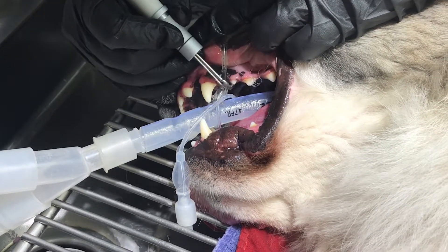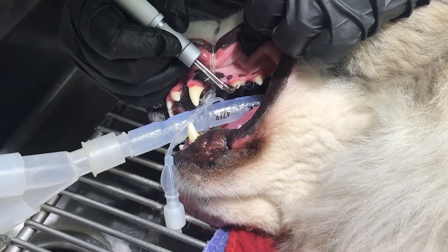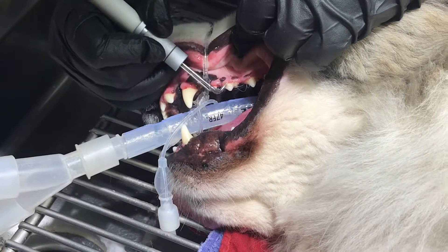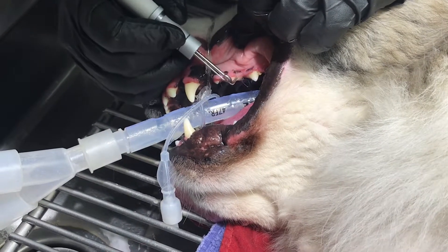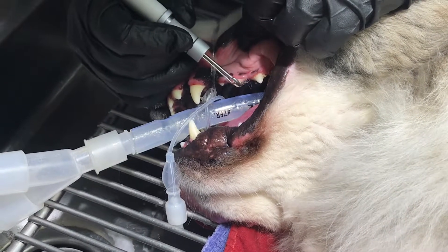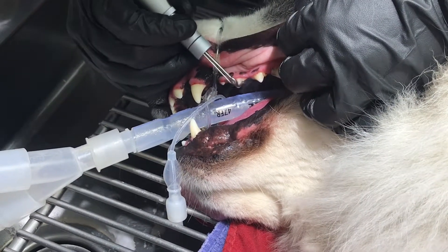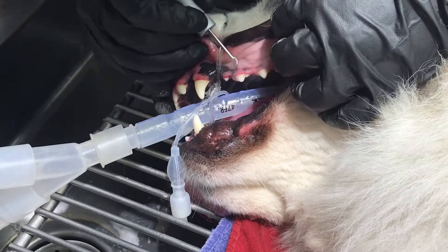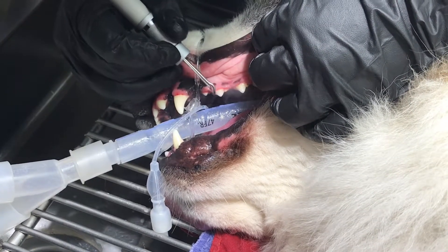Once Sarah's done, I'll go back through and do an exam after she gets them scaled. She'll do x-rays after scaling, and then I can evaluate the x-rays while I'm doing my examination. During that, I'll do some hand scaling with a hand instrument so I can actually feel those little deposits that you can't necessarily detect with an ultrasonic scaler.